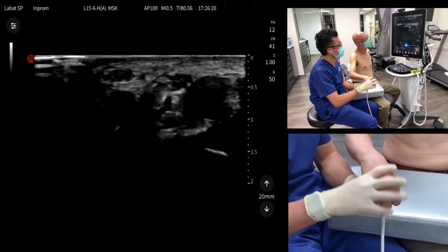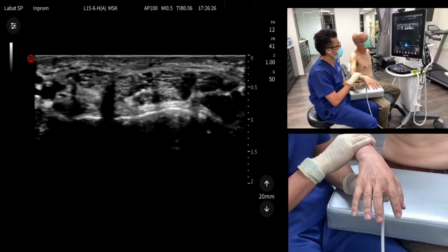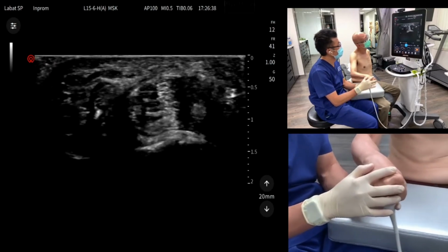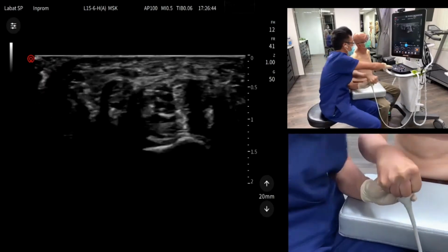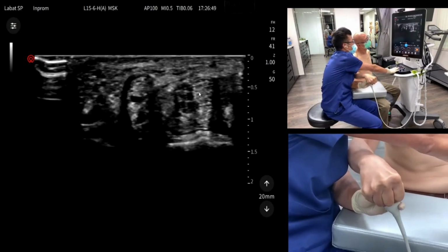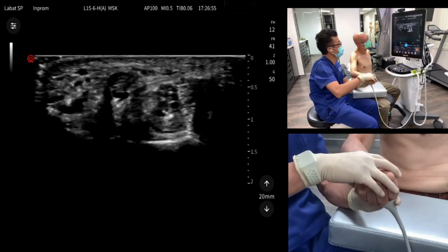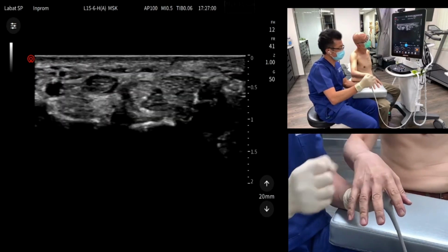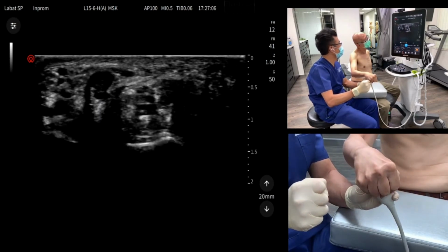Well, let's take a look at if we have the Robin doing this. Okay, this time, please do that. Relax. Hold the fist. Oh, now you have the flexor pollicis longus squeezing the median nerve. This is the nerve, and that's the flexor digitorum tendons, probably superficialis, and this is the flexor pollicis longus. And then relax. And then when you relax, the median nerve is still between that. Okay, squeeze again. Oh, this time it's coming in now.